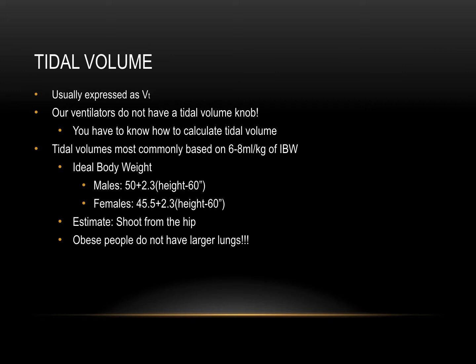So you need to understand that just because someone's obese and has a lot of tissue mass does not mean that their lungs are proportionally larger. So you need to use lower tidal volumes, otherwise you can cause barotrauma. So keep that in mind.